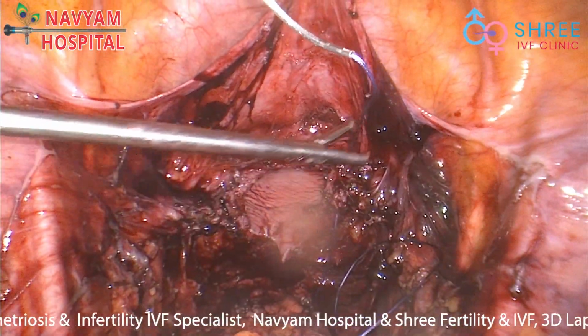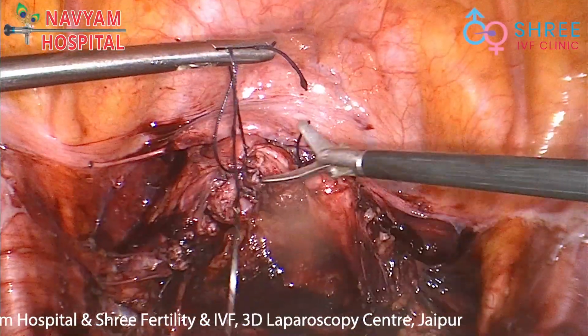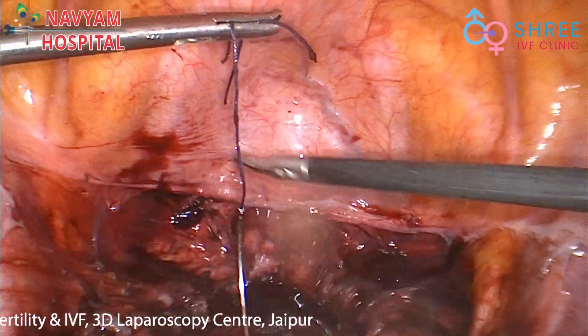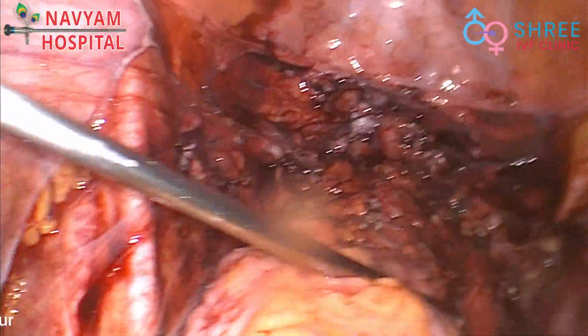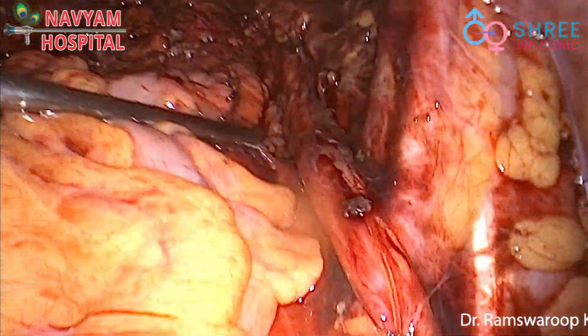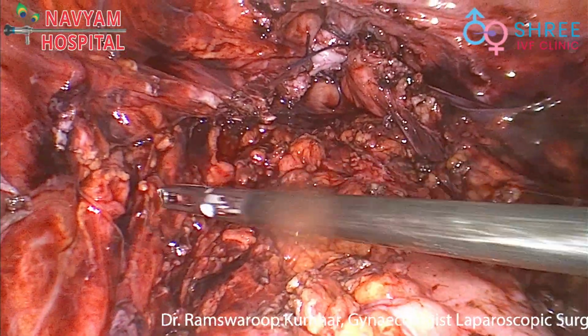The vault was sutured, hemostasis was checked, thorough cleaning was done by suction irrigation, and both ureters and the rectum were checked, and everything is fine. Thank you very much for watching with patience.